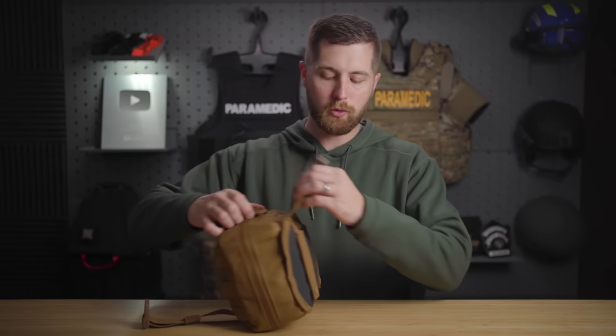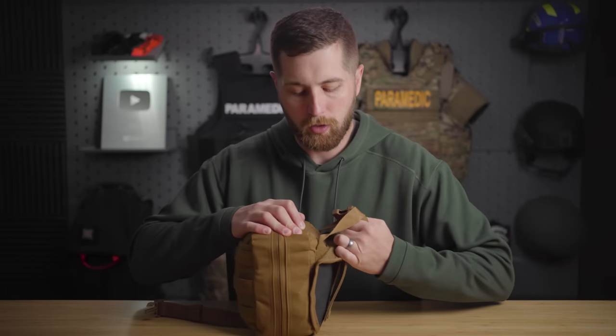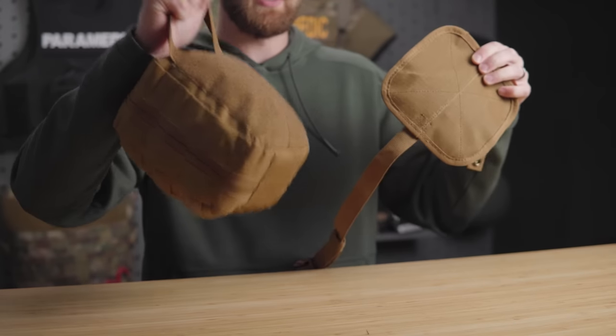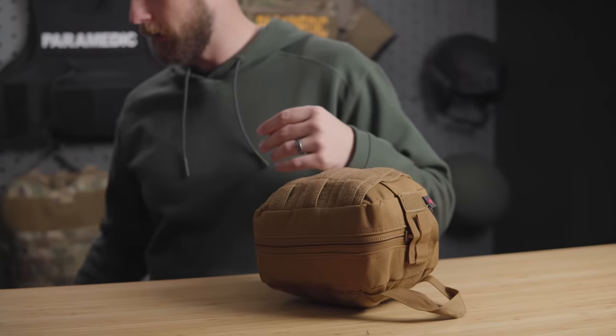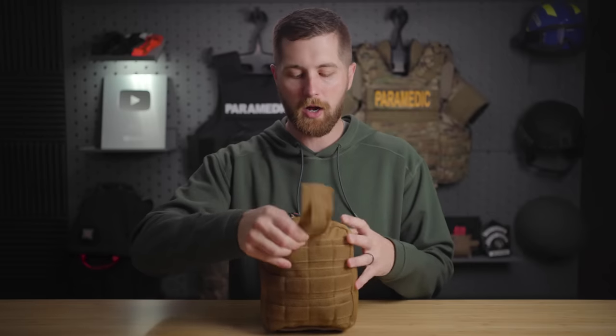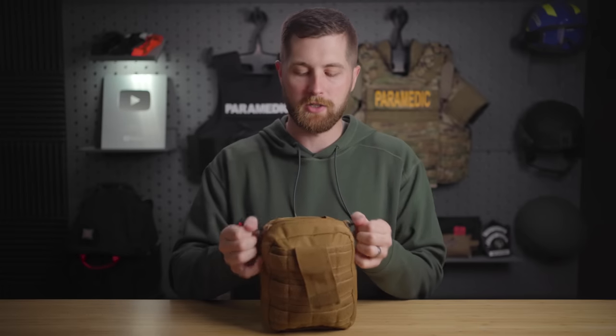There's a clip on the front and a MOLLE backing so you can put this anywhere you want. This is not a professional operator's kit — you're not going to put this on a plate carrier; it's simply too bulky and that's not what it's intended for. You could, however, put this on a backpack or on the headrest of your car, and it will come off and allow you to quickly deploy the kit. Coming into it, there's one extra closure. Honestly, you could probably cut it off — it's just one more thing to get through and isn't really accomplishing anything.